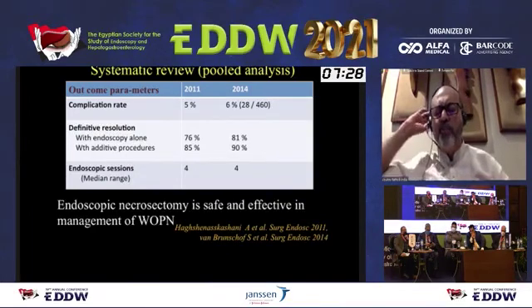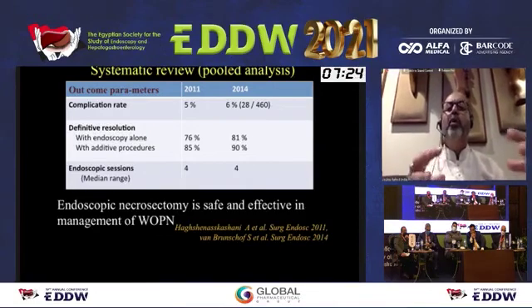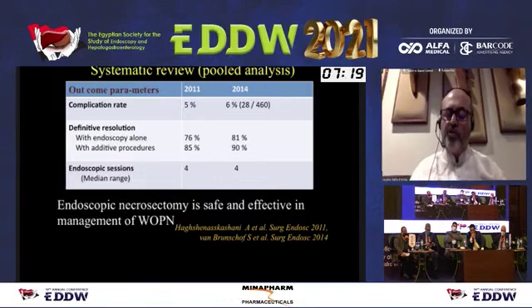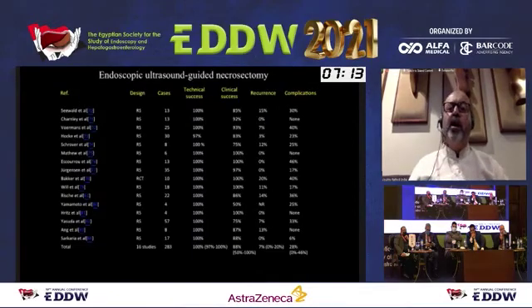So it leaves very little doubt in my mind, at least, that if you have a patient with infected necrosis with a single large cavity, then you can have a very good outcome with a combined approach, both endoscopy as well as percutaneous tract route.